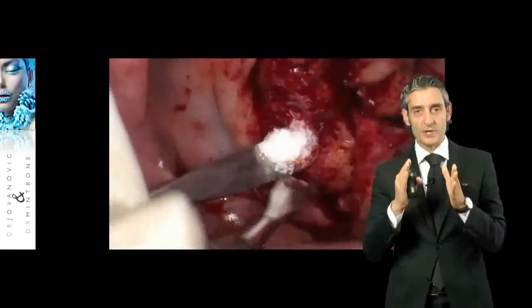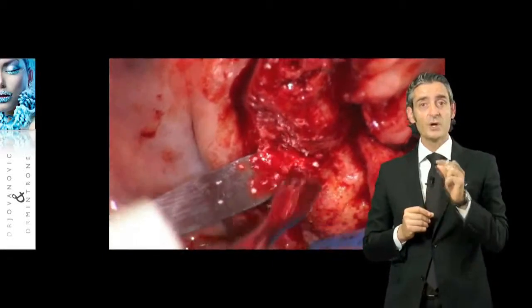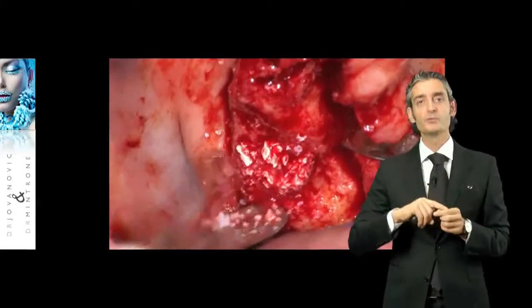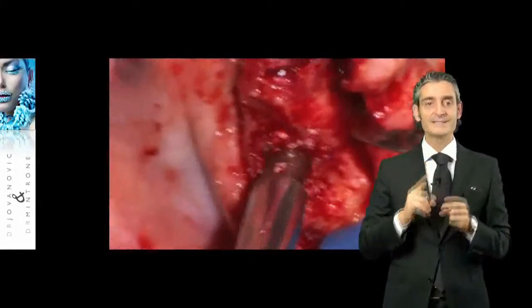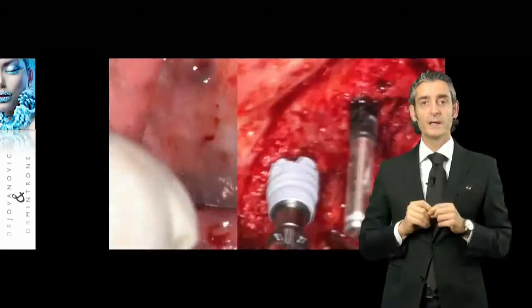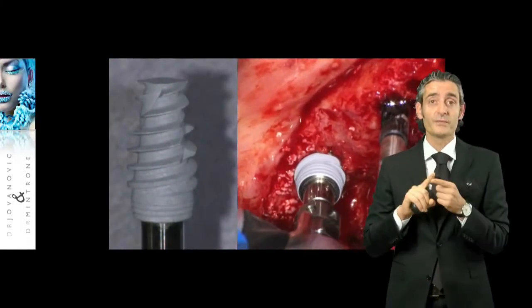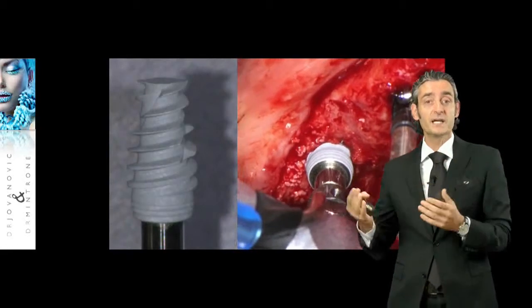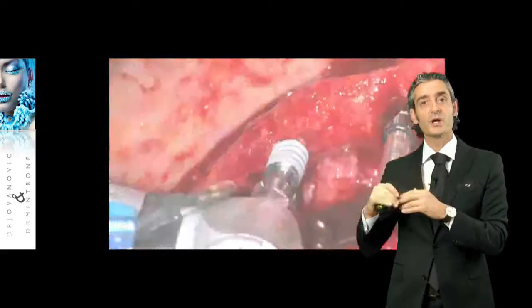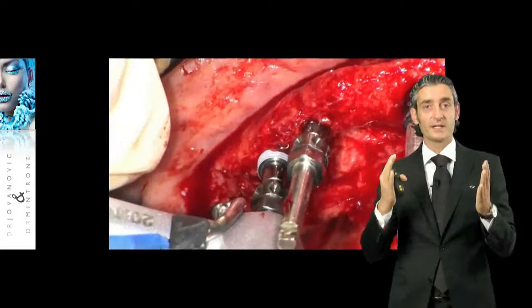What is interesting in a case like this is that in some areas, for example in the central incisor, we place the implant sticking out from the bone because in that area the target was to make a GBR. In other areas, for example in the canine, where there was no pink tissue in the radiographic stent, or rather in the analysis, we found there was more bone than we need. We keep the implant deeper and we use the bone that was there over the implant to obtain the graft in that area.